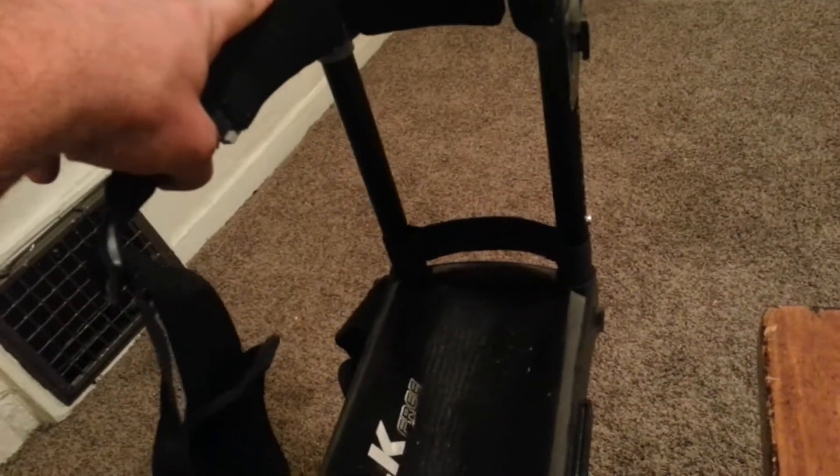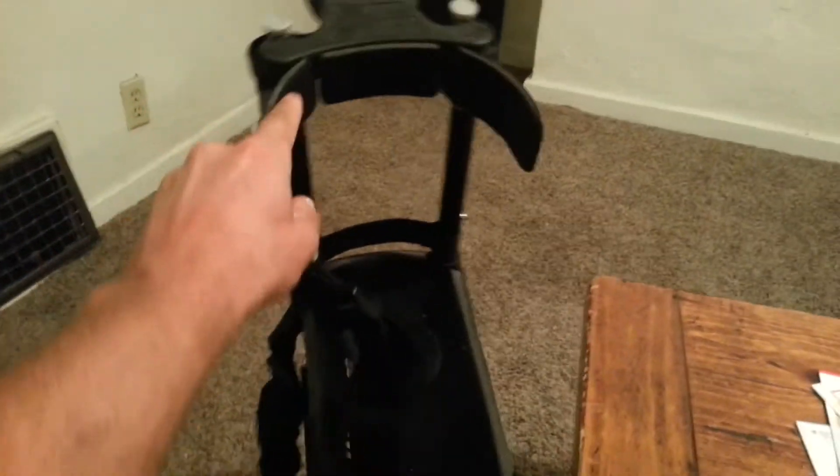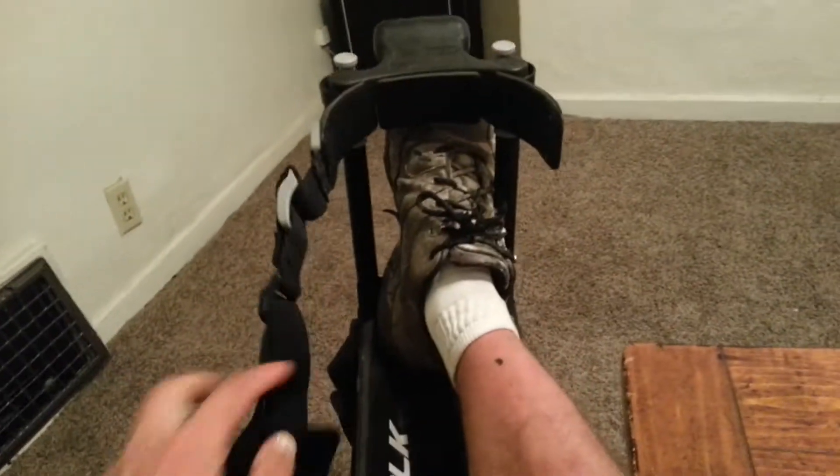Another thing I really like about this as opposed to crutches — you just take it off. In my case, after I broke my foot and had surgery on it, you have to keep your foot elevated. You can easily cradle your foot in there to keep it elevated when you sit down. You can't really do that with crutches. So I've been pretty happy about that.